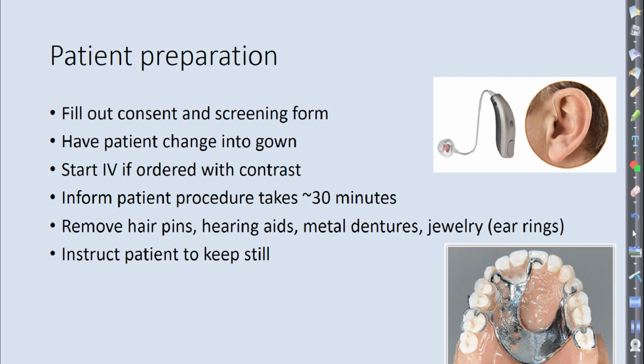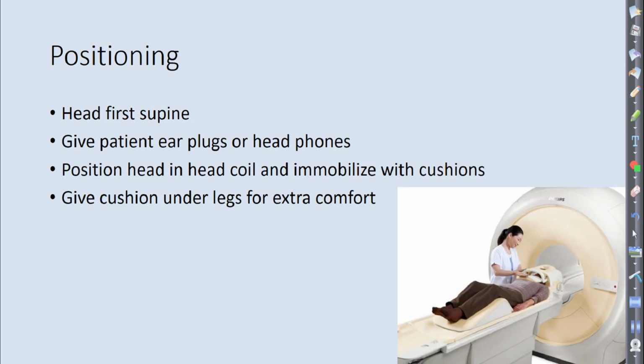So starting IVs for these is really important. Most of these take greater than 30 minutes. Remember, give them a good time frame. Always overshoot it if you have to. Remove all the metal. Positioning is a little different.